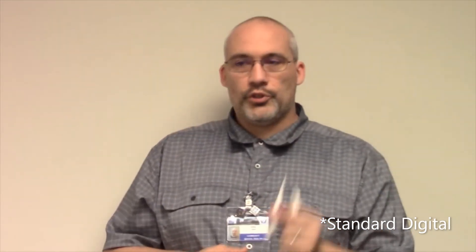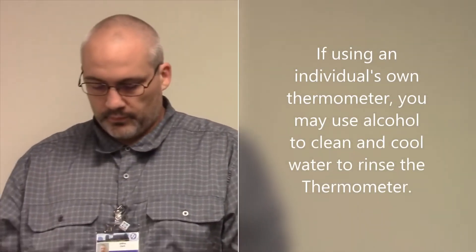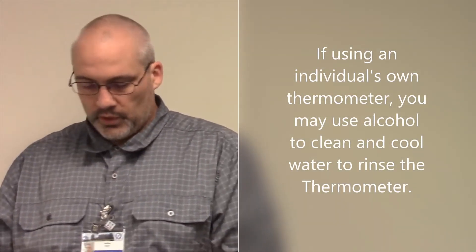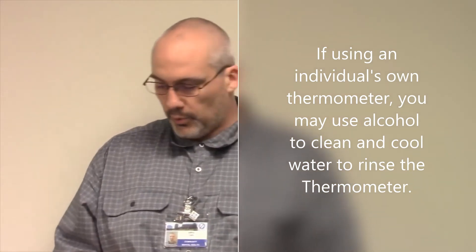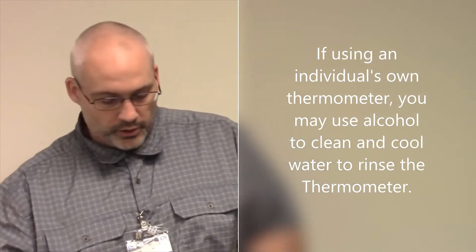I'm going to demonstrate how to use a standard thermometer. First thing we're going to do is make sure that the thermometer itself is clean. For this you can use an alcohol pad. Clean the tip off with the alcohol pad, and then we're going to go ahead and use a probe cover.